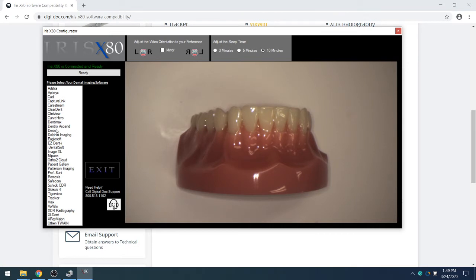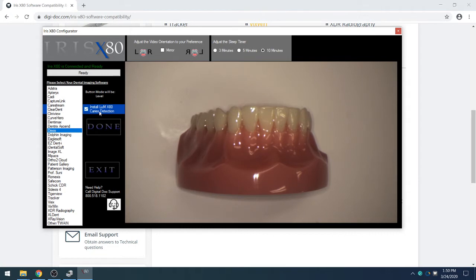Now we will select the dental imaging software and if we'd like to install the Lume X80 caries detection, and select Done.